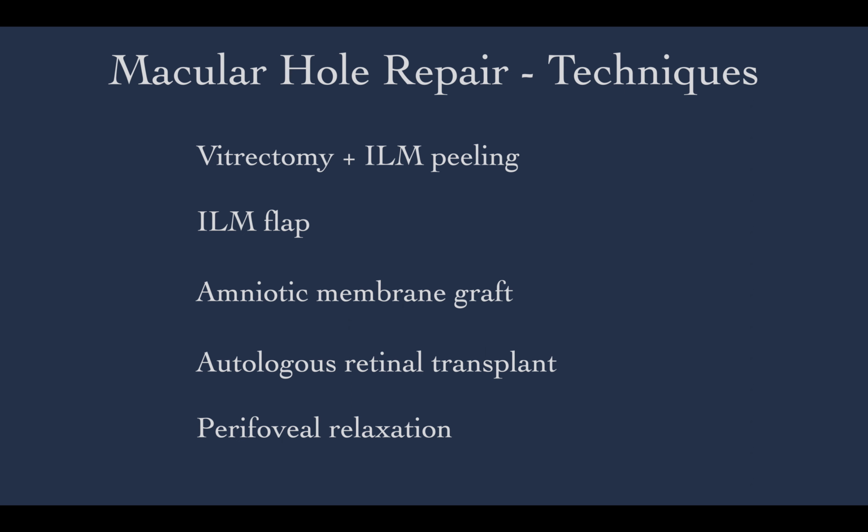ILM flap may also induce the detachment of the edge of macular hole, allowing closure. The third technique is amniotic membrane graft for treatment of chronic and refractory macular holes.